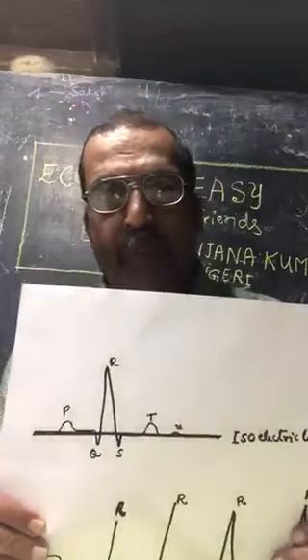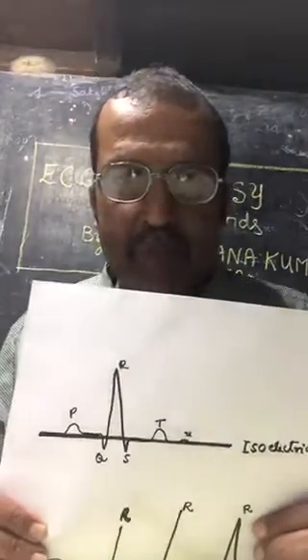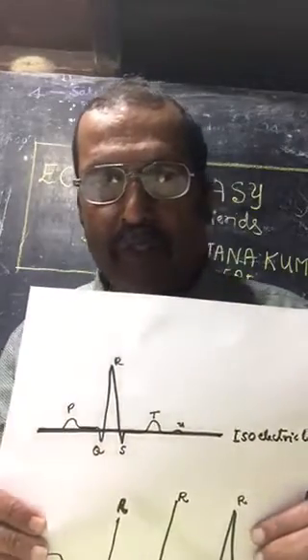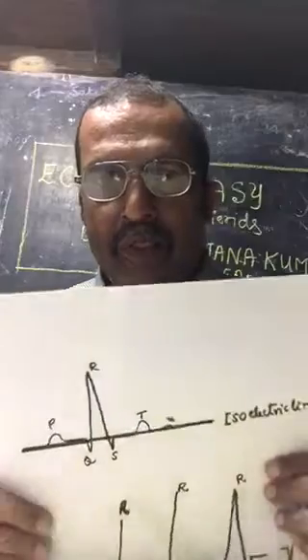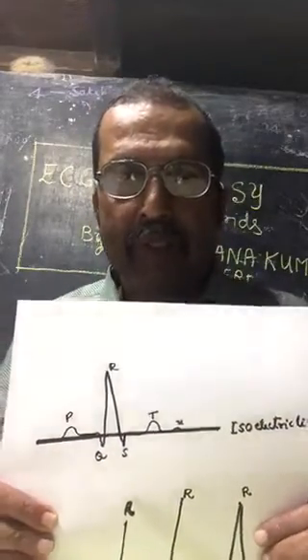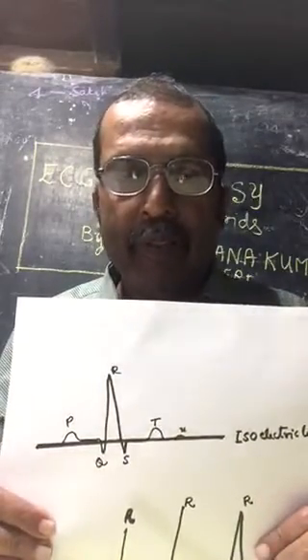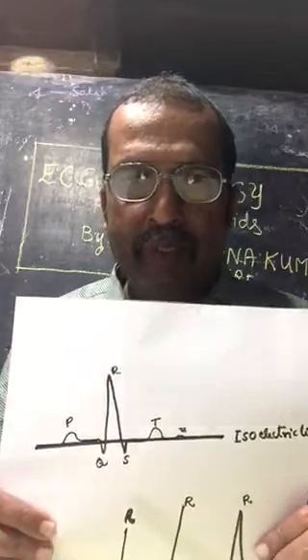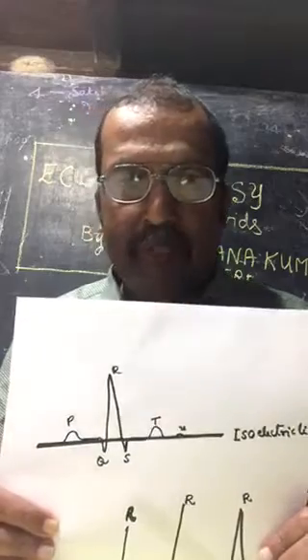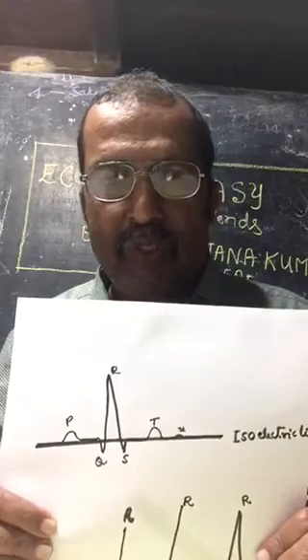Suppose in spite of your aspirin, streptokinase or heparin, the ST segment is not coming down to the baseline, then the patient is not responding to your treatment. Then you should say it is a case better to be shifted to higher centres.